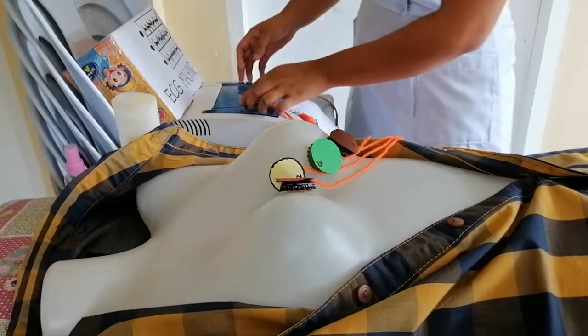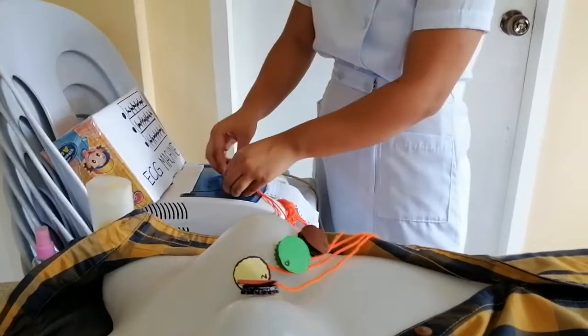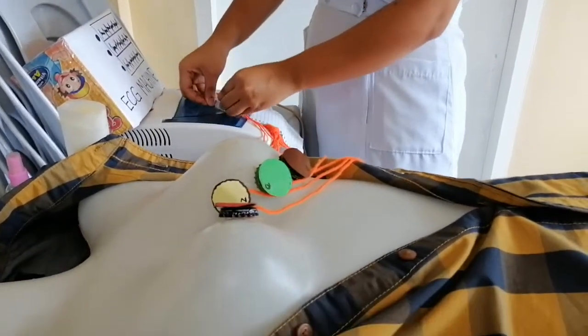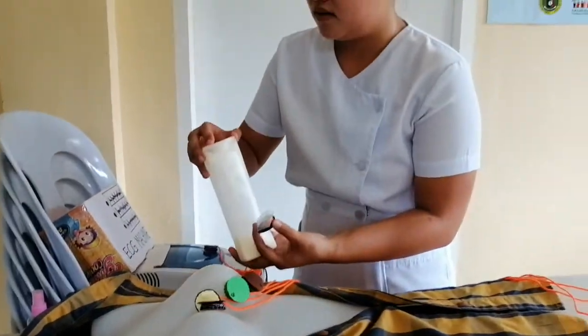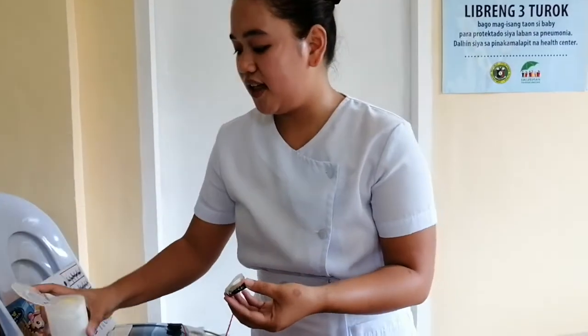After placing the V3, V5 is now ready to be placed. The V5 will also determine the lateral part of the heart. So, place an electrogel.